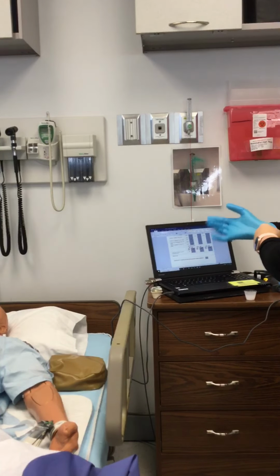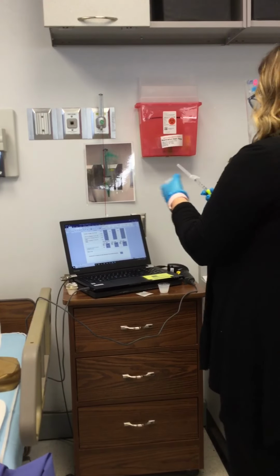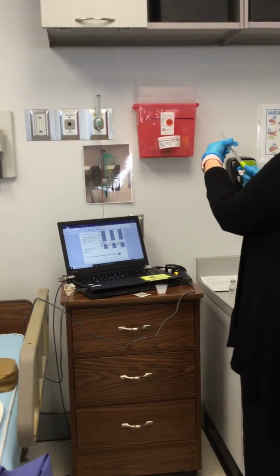And the last thing I'm going to do before I give this, which I probably should have done before now, but we're improvising, is I'm going to change the needle, drawing back air to get all the solution out. Getting rid of that, putting on my fresh needle because I don't want to poke a patient with a needle that's been through a rubber stopper. And I'm going to move it back up to my 2, and I now have a new needle for my patient.